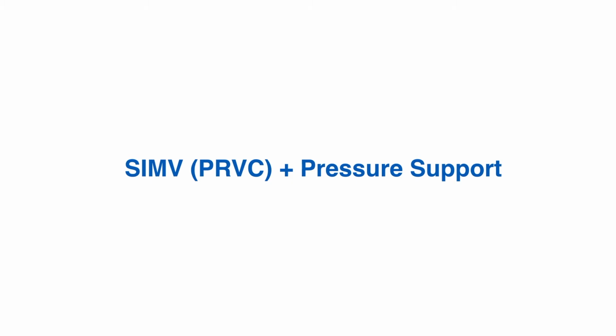So to explain that fully, I'm going to need to tell you a little bit about SIMV. So SIMV stands for Synchronized Intermittent Mandatory Ventilation. So what does that mean? I've said to you in the pressure control, the breaths are given, say you've set a respiratory rate of 30, the breaths are given every 2 seconds, regardless of what phase the patient is in their ventilatory cycle.